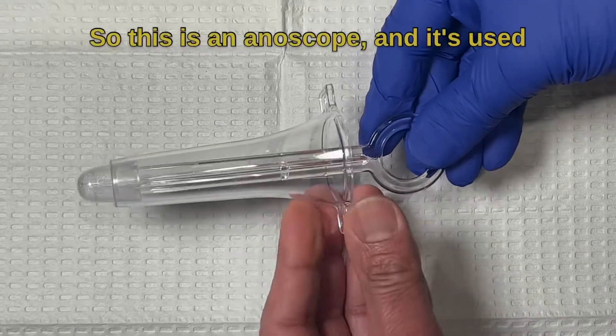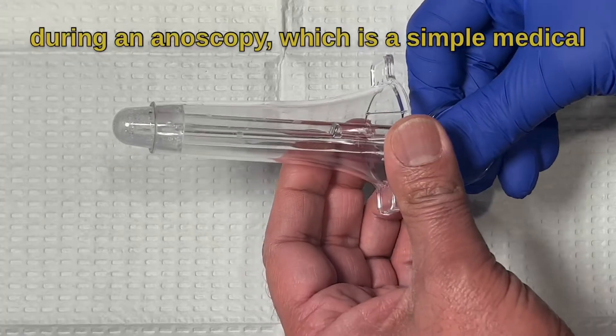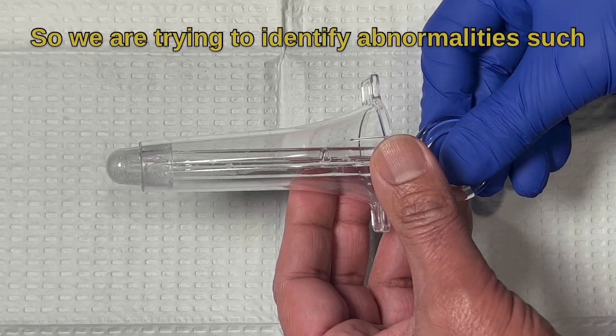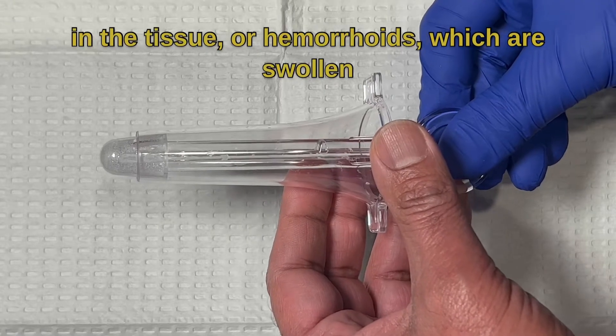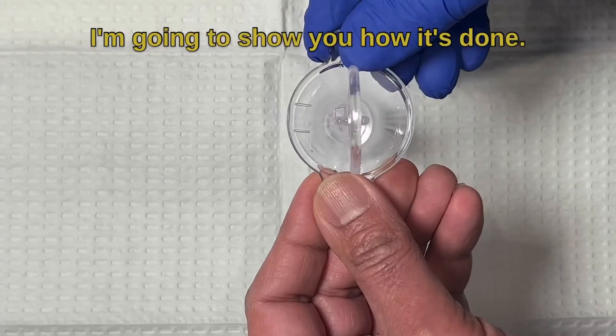Today we're going to talk about anoscopes. This is an anoscope, and it's used during an anoscopy, which is a simple medical procedure that we do in the office. It lets us check out your anus and rectum. We are trying to identify abnormalities such as cancer, anal fissures — which are tears in the tissue — or hemorrhoids, which are swollen veins around the anus and rectum. I'm going to show you how it's done.